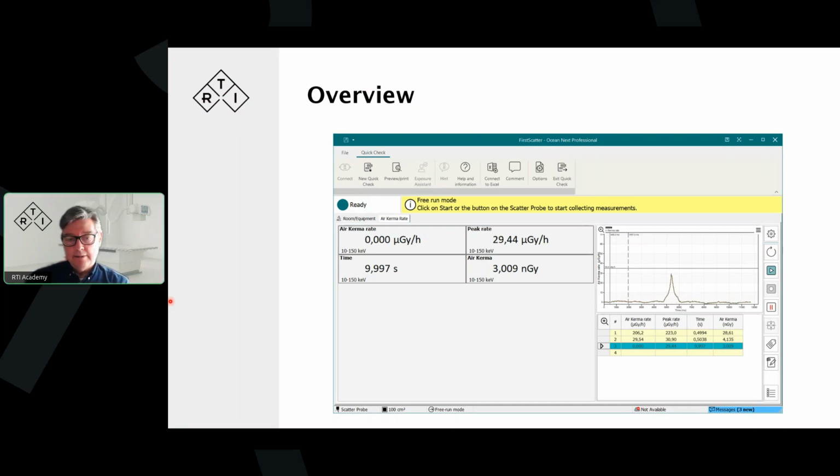So I don't have any other suggestion than to reset, and that sets it to 0 background radiation at the point of reset at that time. Of course, background radiation may vary depending on where you are. So that impacts it, but there's not much to do. We need to have one defined 0 point, and that's when you make the reset. That's it, reset to that background radiation.